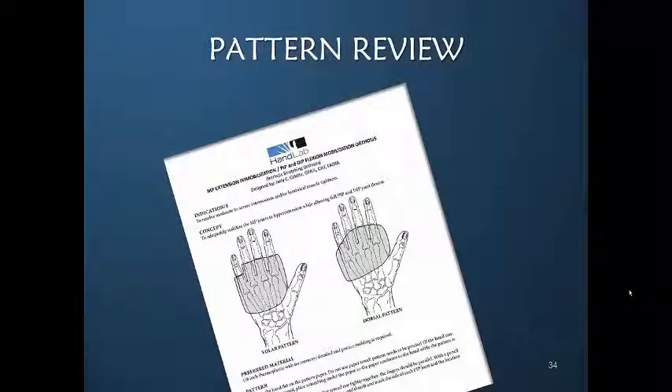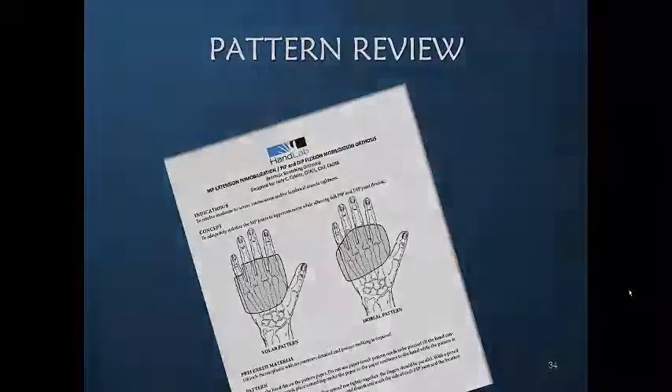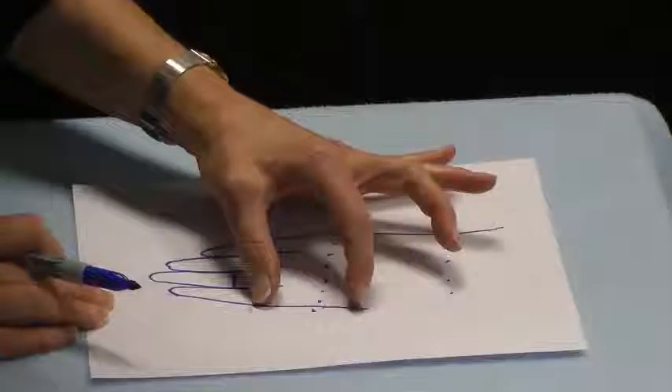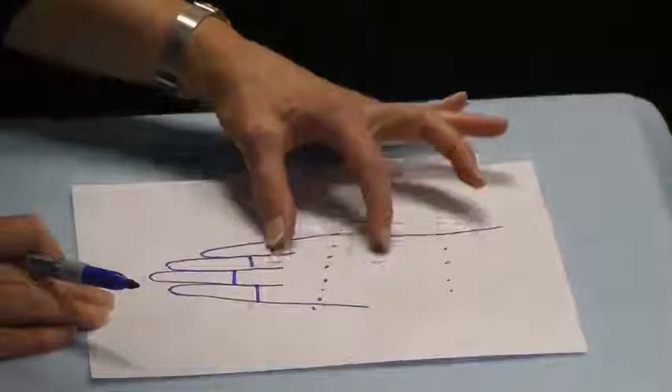You will find a description of how to draw this pattern in these illustrations. Now we're doing the dorsal pattern, so what we're interested in is material that will go across the MP joints.